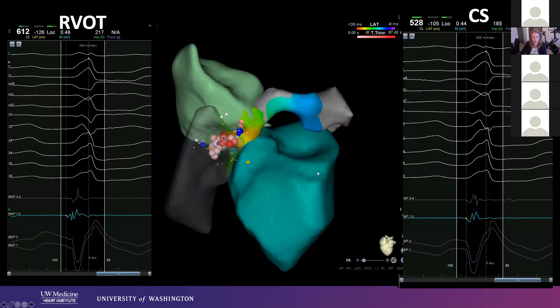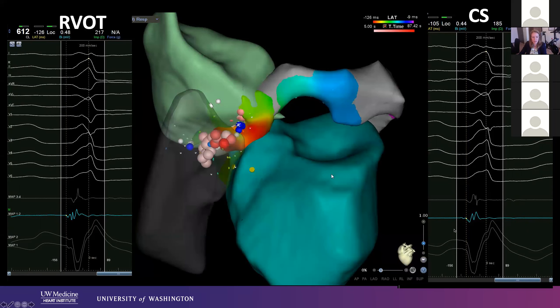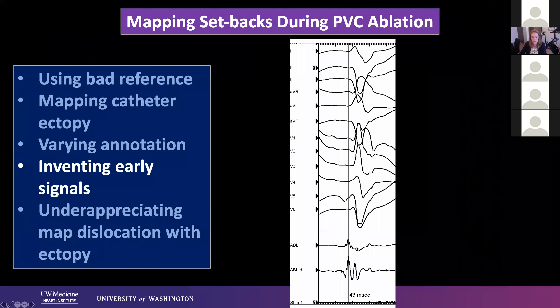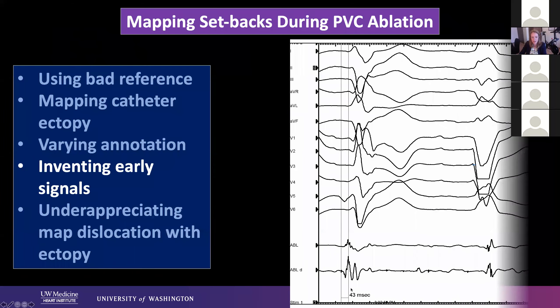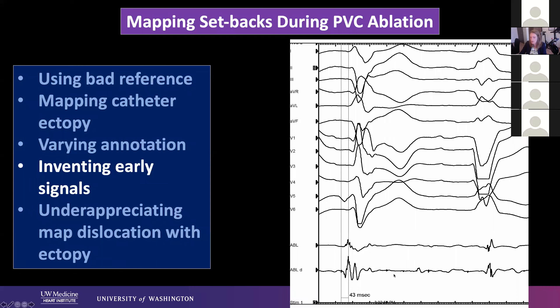Here's an example where we were in the RVOT, and with one particular annotation it looked like we were pretty early there, whereas in the coronary sinus we looked late. But the coronary sinus was being annotated a little bit later. If we moved that coronary sinus annotation forward, now the CS was the place to be — and pace maps had looked good at both sites. Inventing early signals: here's an example on a papillary muscle where I thought I had a fascicular potential before the QRS. But looking at the whole strip, that potential wasn't there with every PVC beat. We all have noisy labs, and those mechanical events — through chordae, through the aortic valve — can create pseudo-electrical signals.